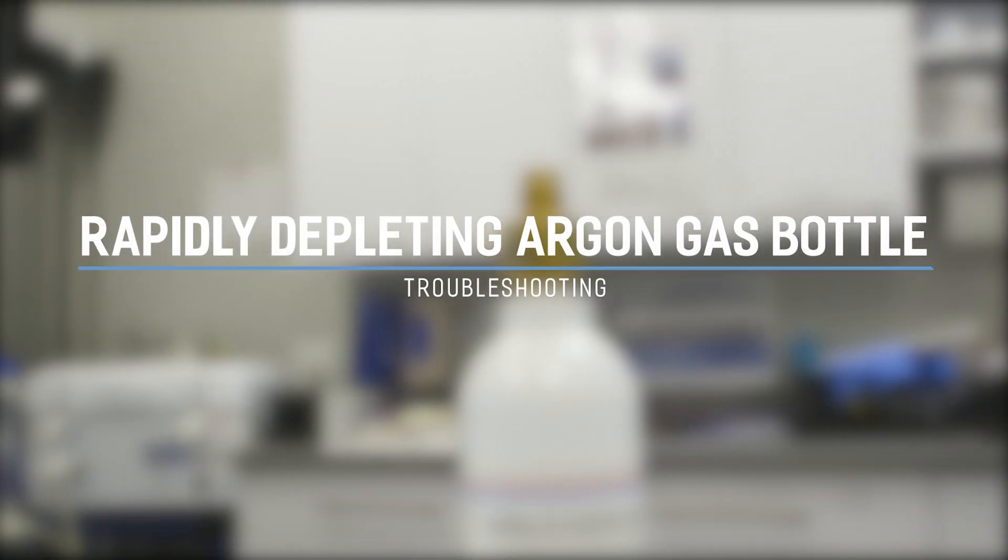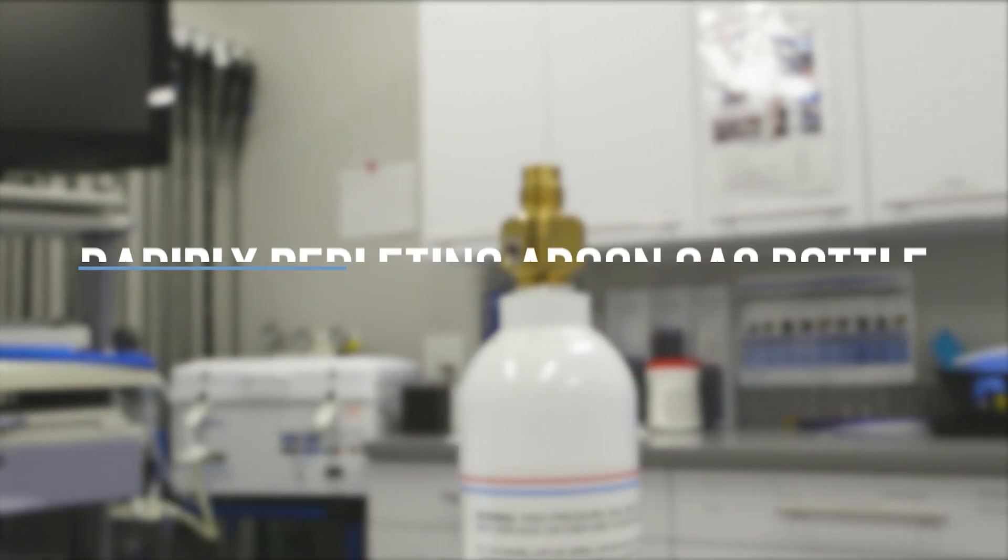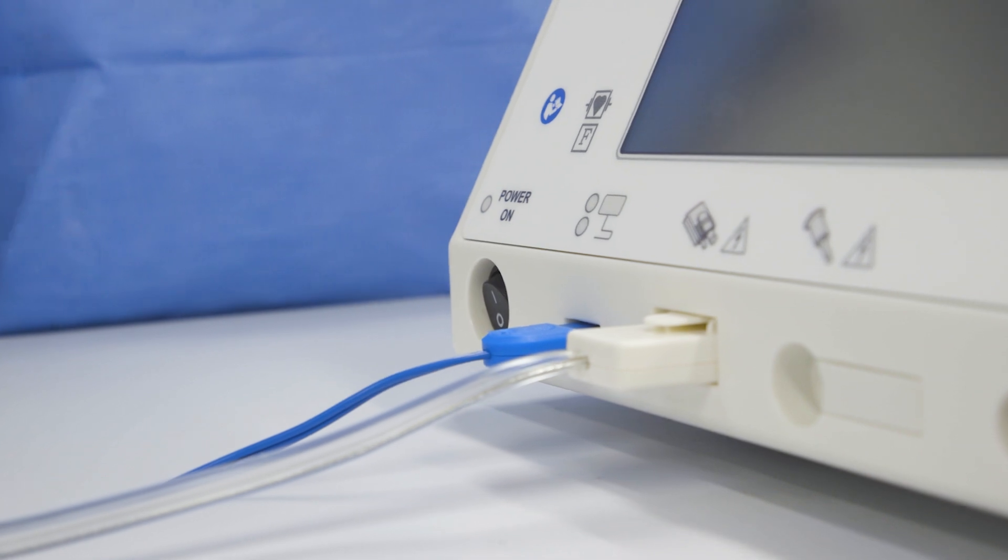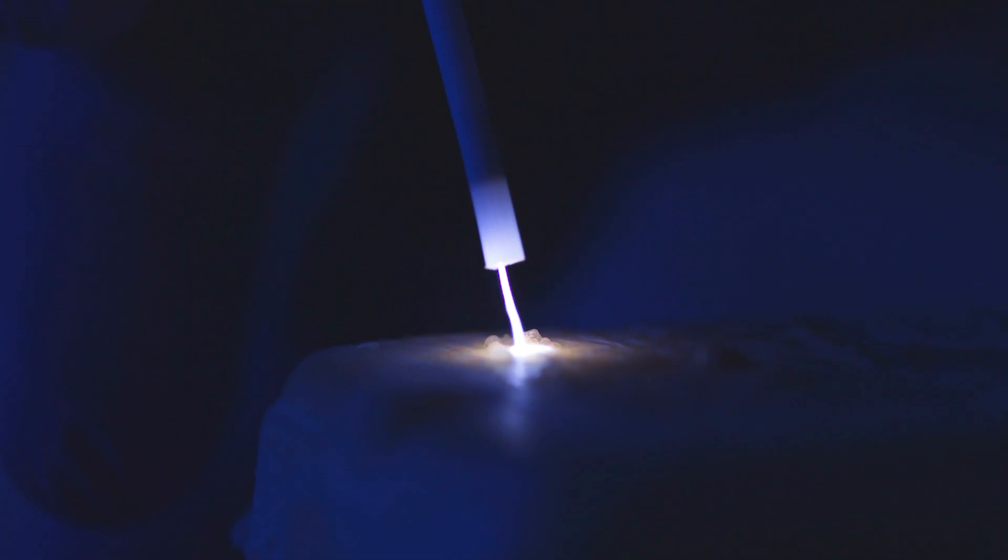Rapidly depleting argon gas bottle. If you observe that your argon gas bottle is rapidly depleting, verify that the GI-4000 is turned off after each case where the argon method is used.